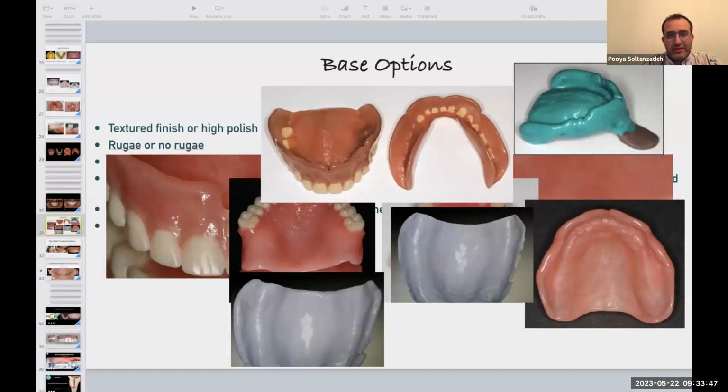So, obtaining the clinical records. This is the trial denture that I mentioned to you. When you do the impression or scanning, they can send you something like that. And this company makes what they call a true-fit denture, if I'm not wrong. They come in 3 sizes: small, medium, and large. And it exactly looks like this. Looks like that.